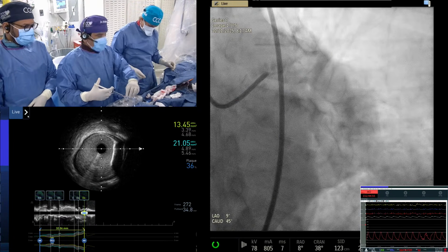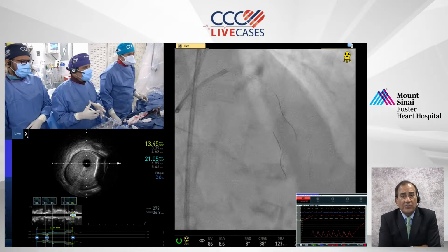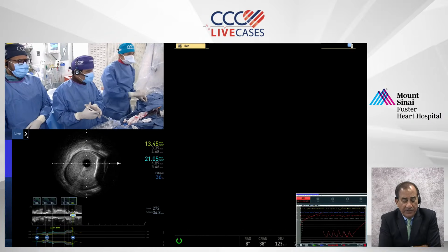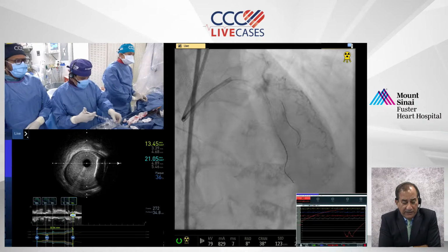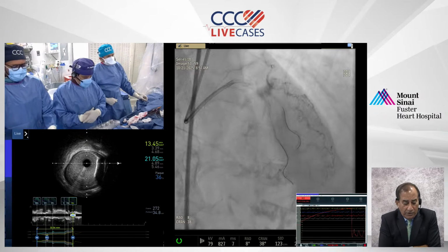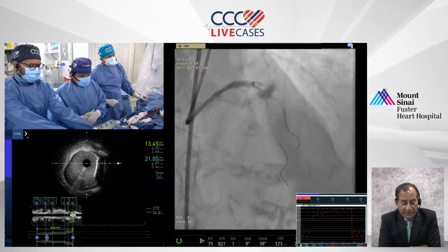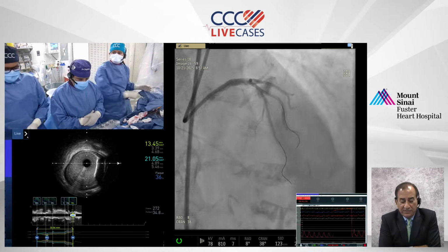So, I mean, we just hit our highest number of viewers at the moment, just to provide you feedback. And the specific question again coming from Nikhil Jha, I'm going to read it. I think it's important for all to know. What is your preferred stent platform for left main LAD stenting considering 2.75, expansion 23.